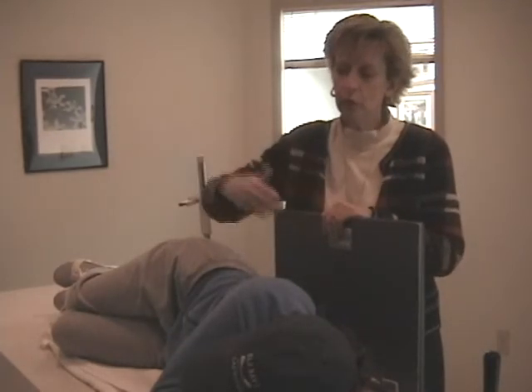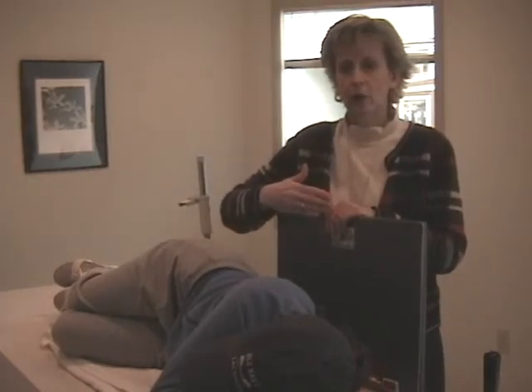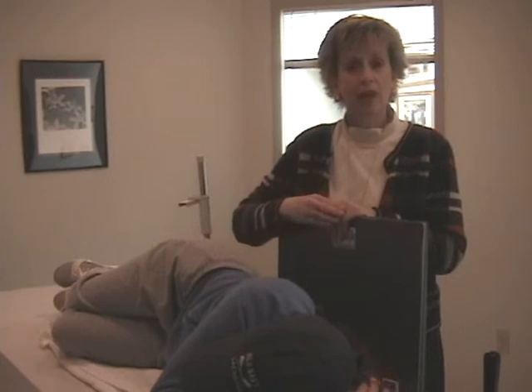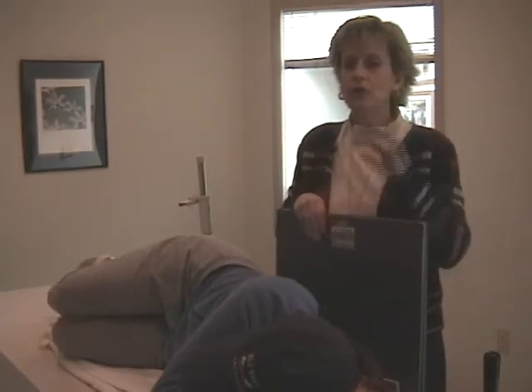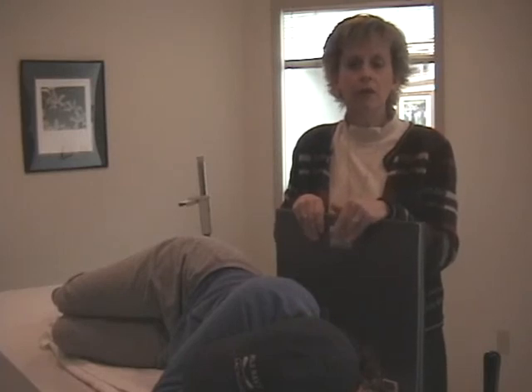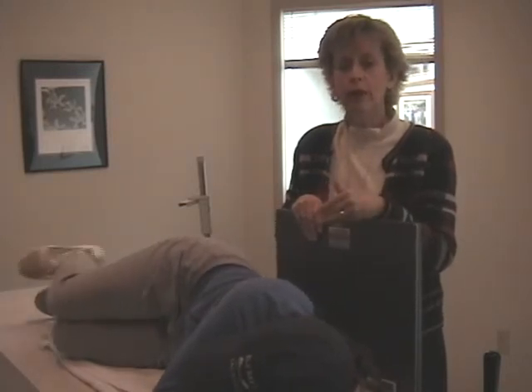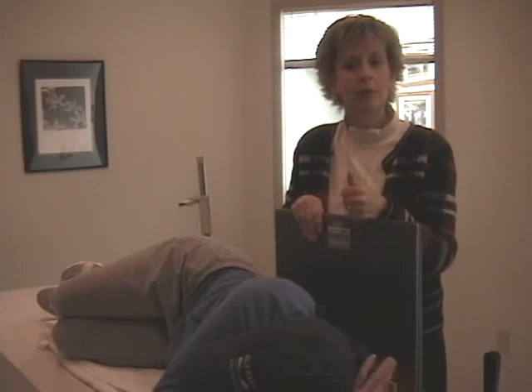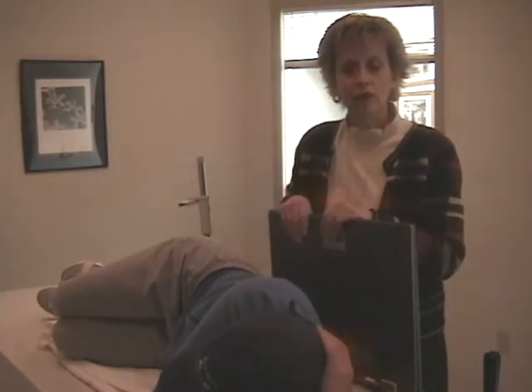This particular room will only shoot the tube shooting this way. And notice how in the original setup I was shooting PA, and if I was going for right side air, I would be shooting AP. Shooting AP versus PA would not have any significant difference. It would not contribute to a good radiograph or not. Knowing which side you're after and knowing whether it's fluid or air, that's critical. Then you shoot AP or PA, whatever your equipment allows you to do.